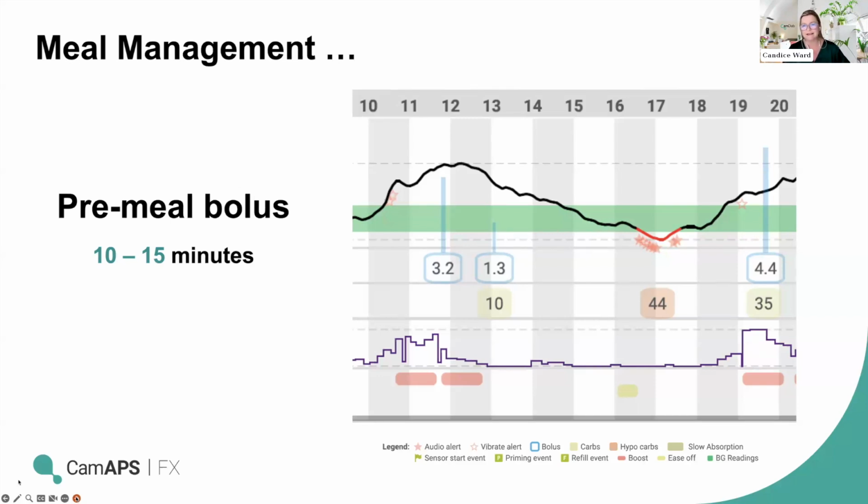If the bolus is late, you often get, as in this graph, this is from the PDF report. If you haven't seen it, you can see this person has eaten early, got alarms, they've put on boost, which is the red at the bottom. The algorithm's helping out. They've then done correction, maybe some more fake carbs, and ended up very hypoglycemic a few hours later because of this mismatch of managing that.